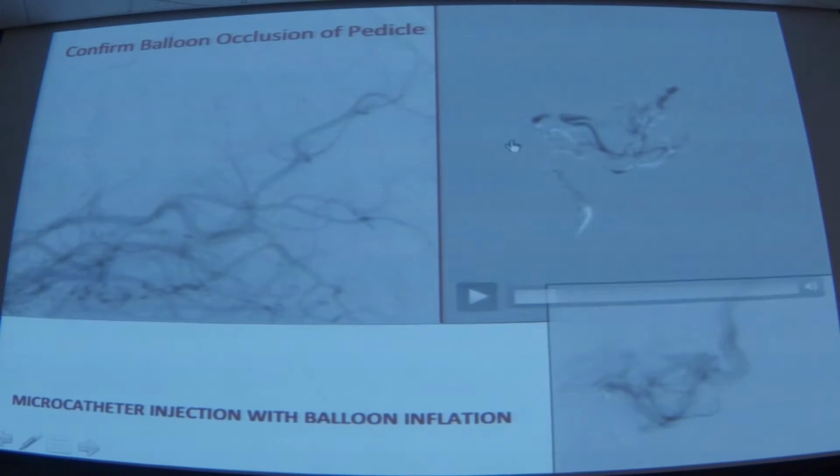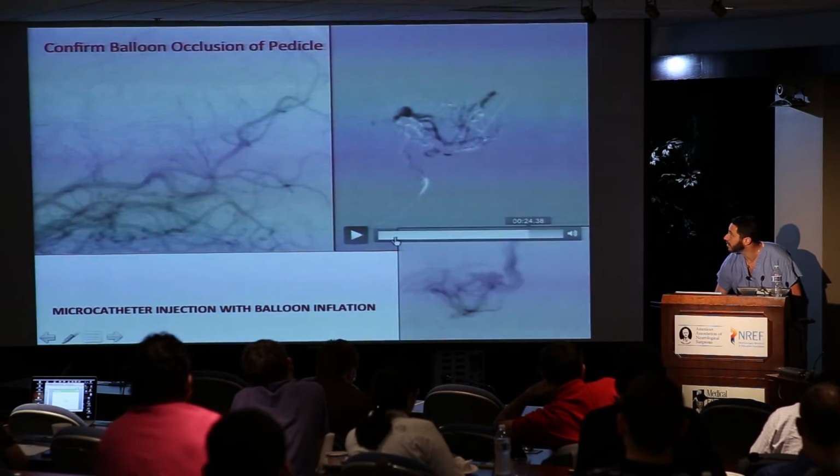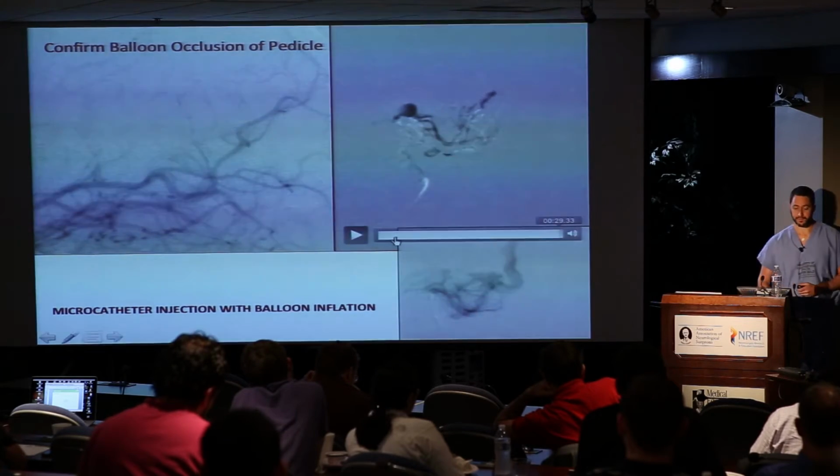I'm not sure that's playing. No, it's stopping when I drag it. So what I want to see is confirmation that I'm in the vein. And just like when we were talking about fistulas, once I've got the nidus, I want to go sequentially: pedicle, nidus, vein. There you start to see a caliber change. And there I'm pretty sure it's the nidus, excuse me, the vein.